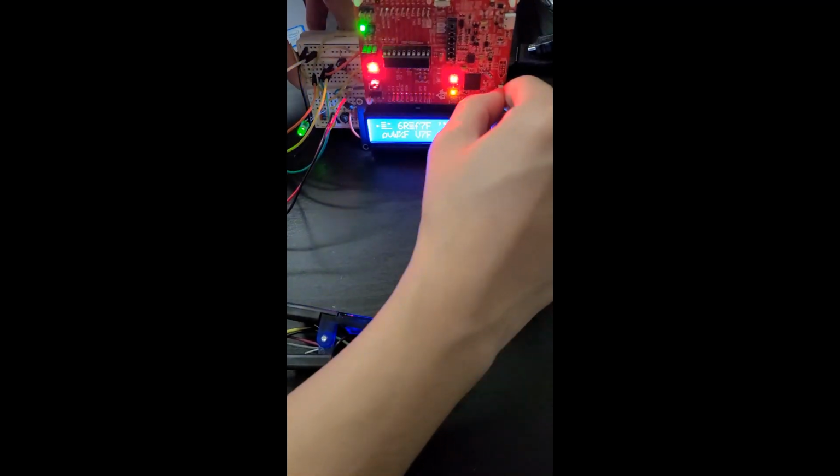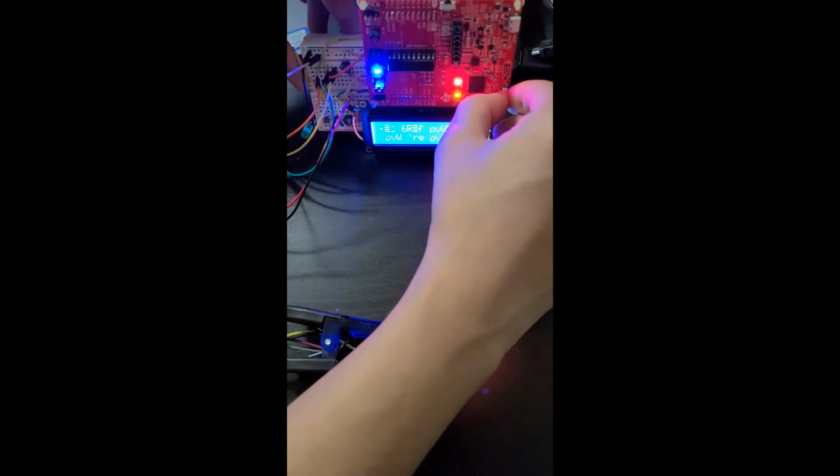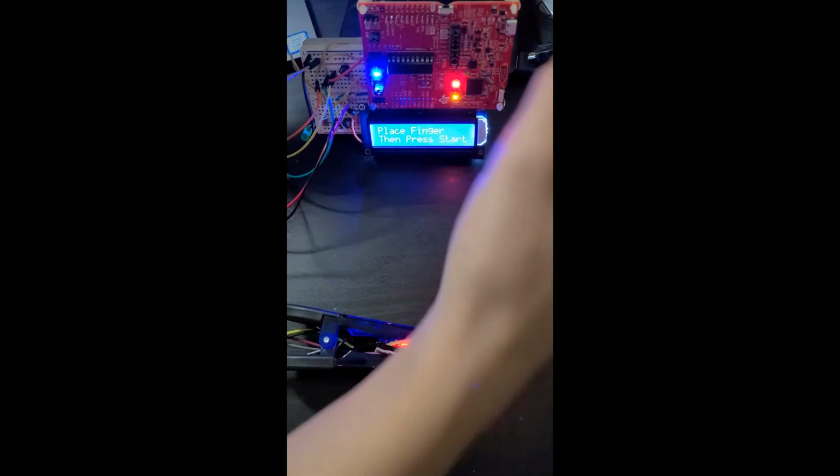One other limitation we have is when we start the device, we might see something like this. And to fix it, we just have to reset our device a couple of times, till we get the right answer.